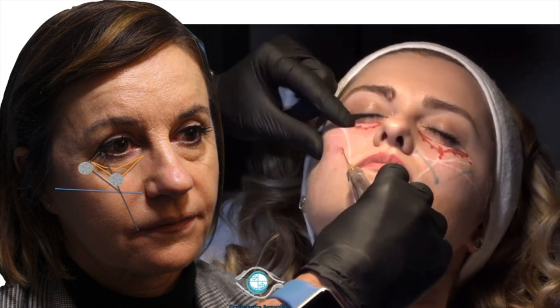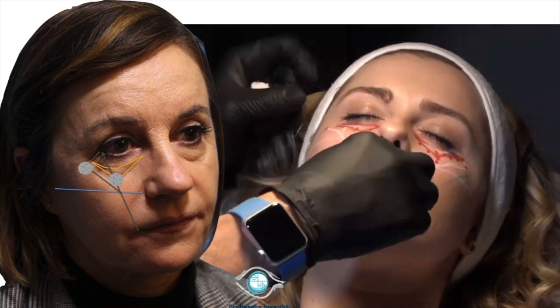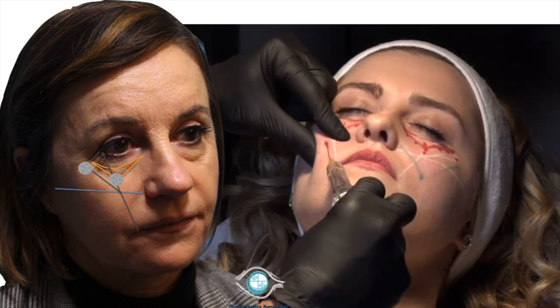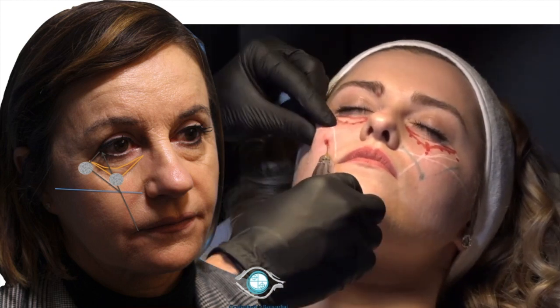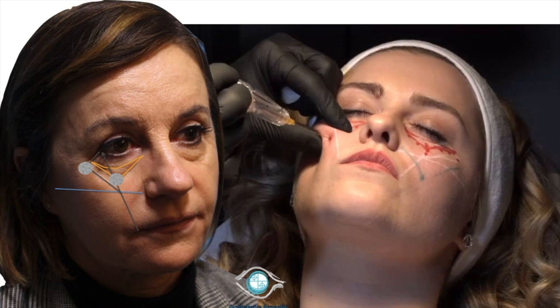We enter in the cheek, and we drive our cannula up to the G-point, where we will deliver 0.1 cc of high G' filler in a macro bolus. We then enter again our entry point in the cheek and start working around the main G-point just to smooth the transition nearby. Following this G-point treatment, we achieve already a stretching of the entire eyelid.